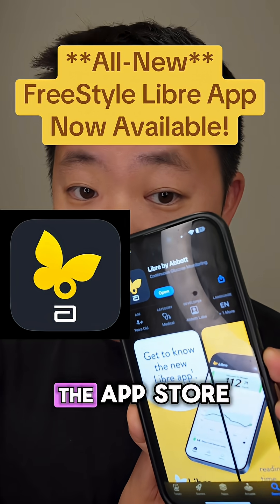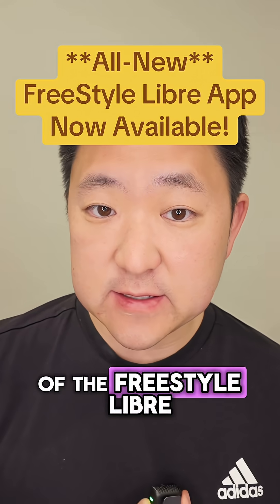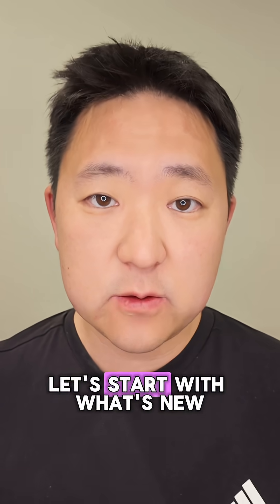There's a brand new Freestyle Libre app on the App Store, and nobody's talking about it. Abbott, makers of the Freestyle Libre, hasn't mentioned it yet on any of their socials or put out a press release. Let's start with what's new.